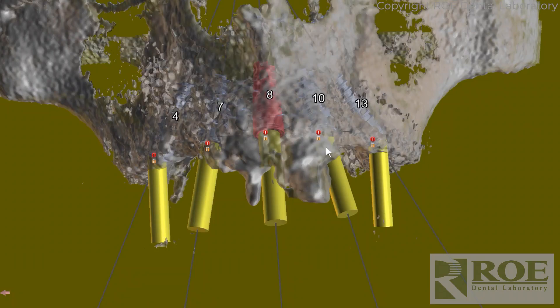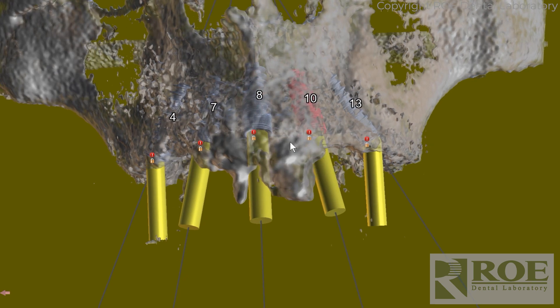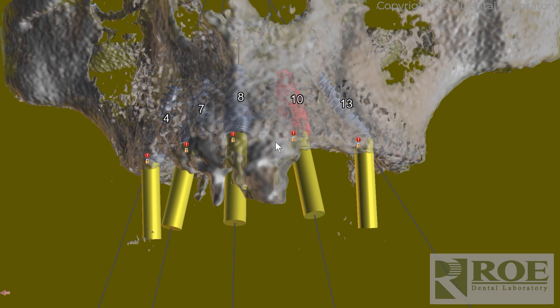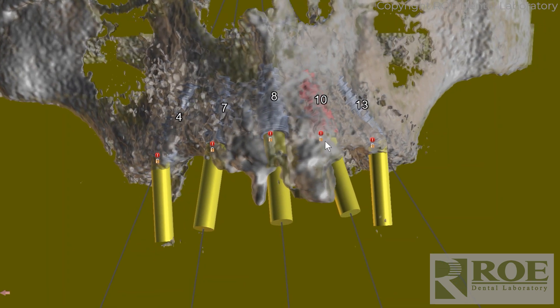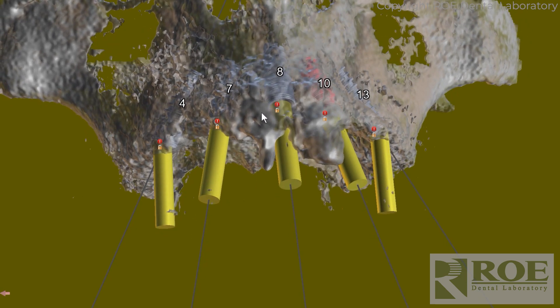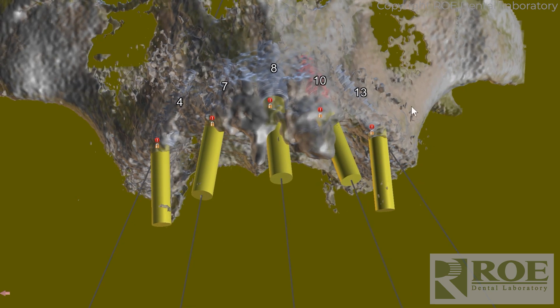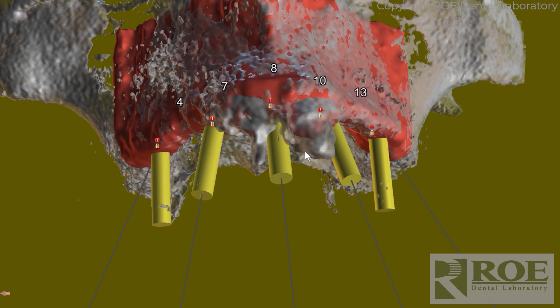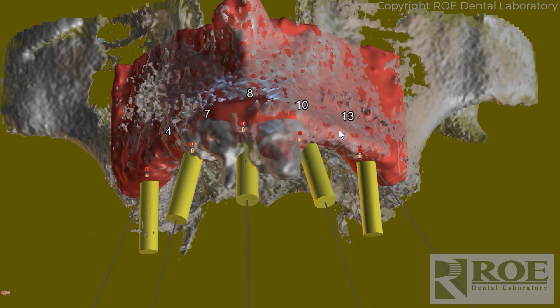When we work on one of these cases we usually work based on just a cone beam. These cases can also have a dual scan with a denture. We can plan all this properly according to tooth position. In this case this was just a CBCT scan and we rendered the bone.